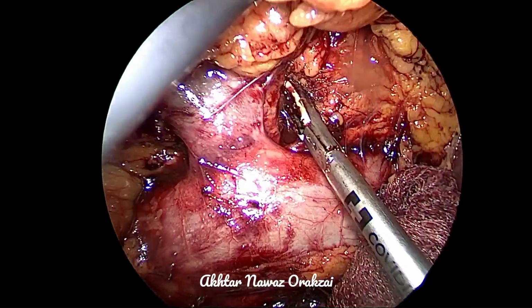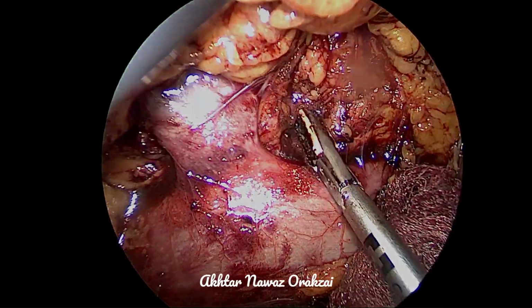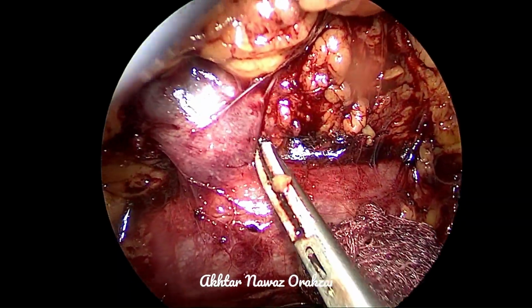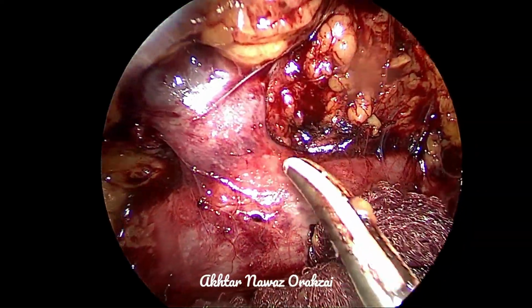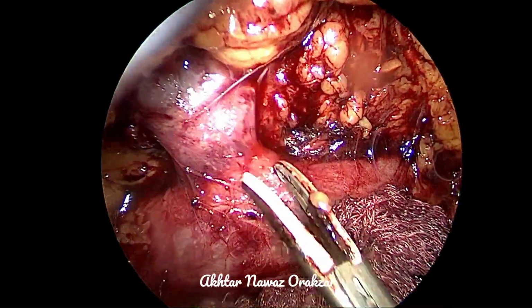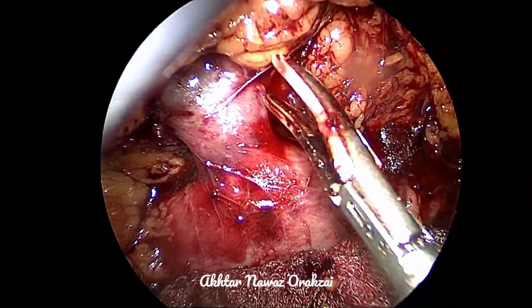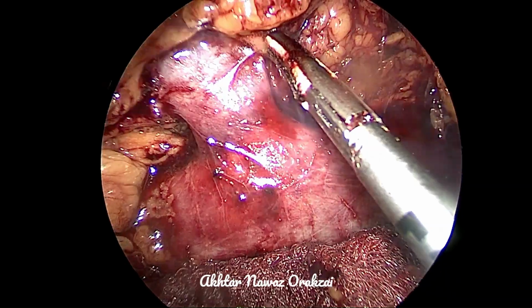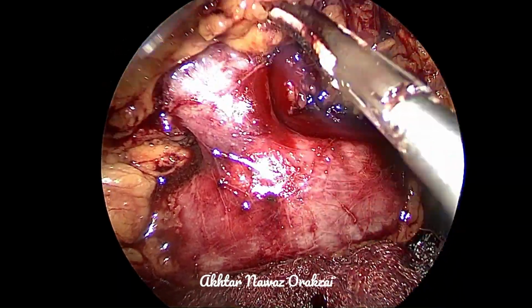So dissection around the artery before clipping the vein is a must, so that if we can apply a simple and single clip on the artery, the diameter of the vein will automatically become smaller and clips can be applied easily.